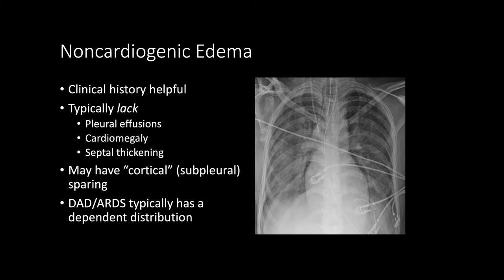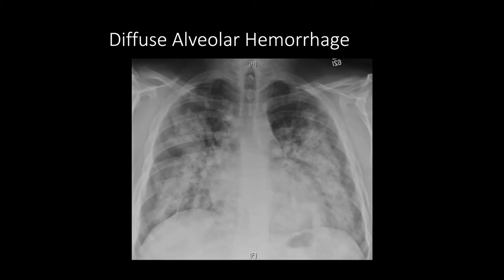In this particular case, the patient had a severe brain injury but no reason to have pulmonary edema, so this was a neurogenic cause of non-cardiogenic edema. Here's another case of a non-cardiogenic edema pattern: bilateral perihilar predominant airspace disease that's symmetric, but in this case we have a normal heart size, no pleural effusions. This turned out to be diffuse alveolar hemorrhage in a patient with Goodpasture syndrome.